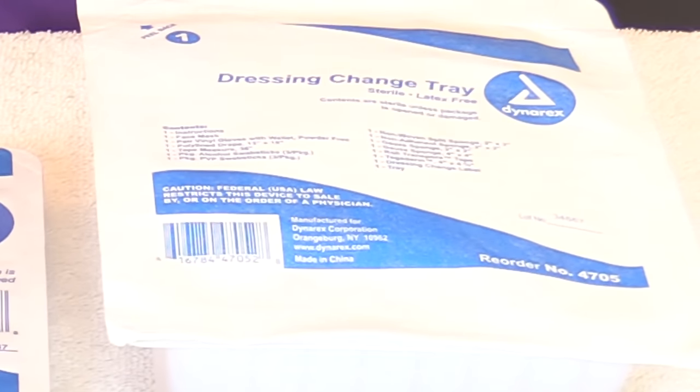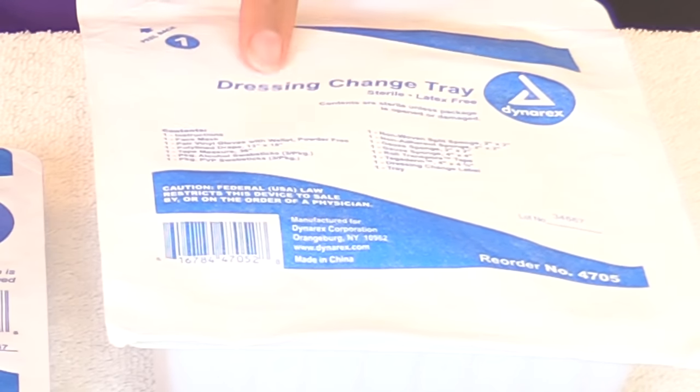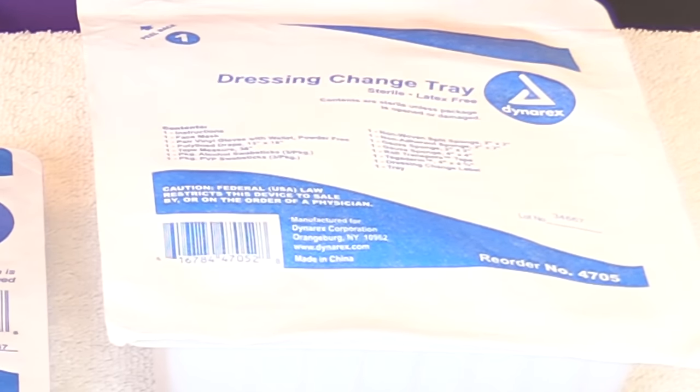Then gather your supplies. You'll need a dressing change tray. Before removing sutures, always follow your hospital protocols — some hospitals require sterile gloves while others allow clean gloves. In this video we'll use sterile gloves. The dressing change tray comes with sterile gloves, a sterile drape to place supplies on, gauze, and antiseptic to clean the suture line before and after removal.